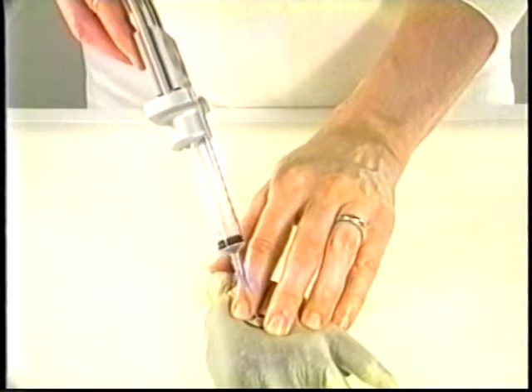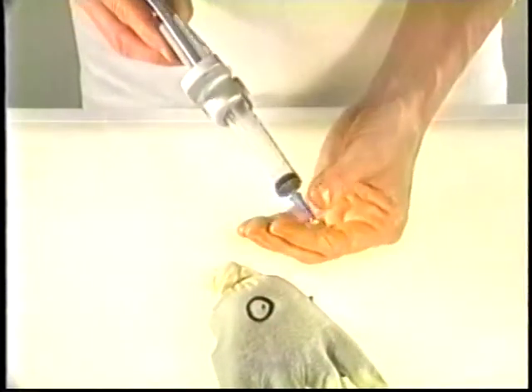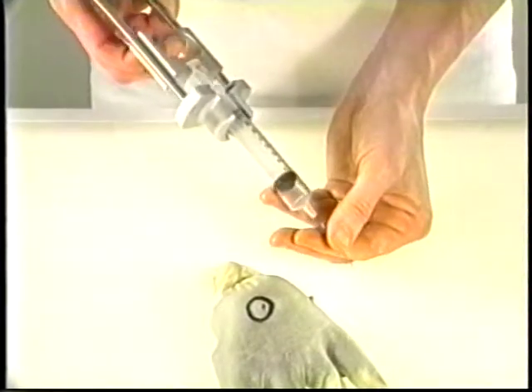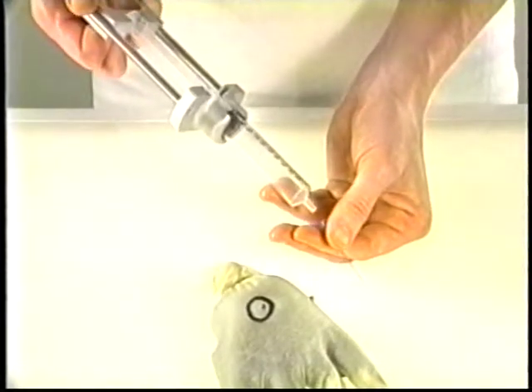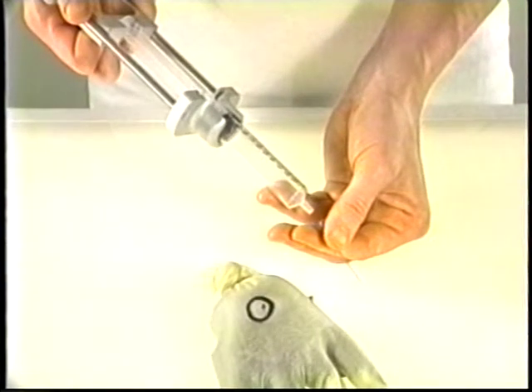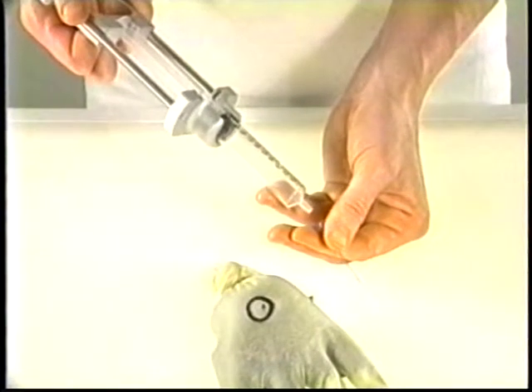Now that the actual sampling is done, the harvest is present within the barrel of the needle, the hub of the needle, and maybe at the tip of the syringe. As soon as the needle has been removed from the patient, the needle is disconnected and the plunger pulled back all the way. It is helpful to have as much air as possible in order to effectively expel the material.